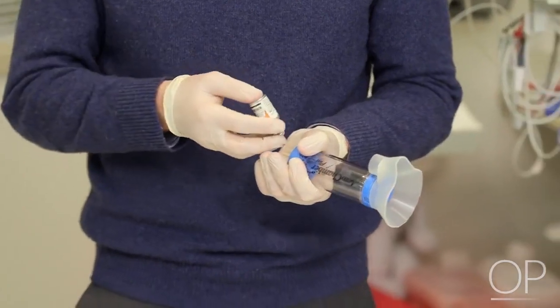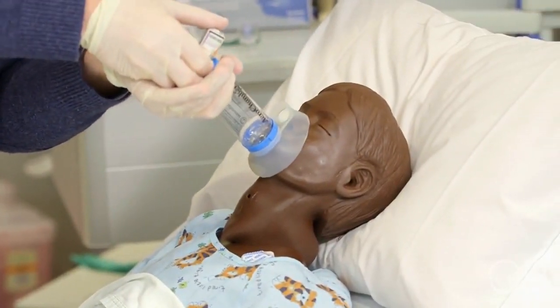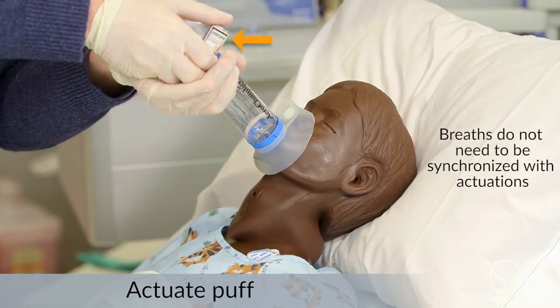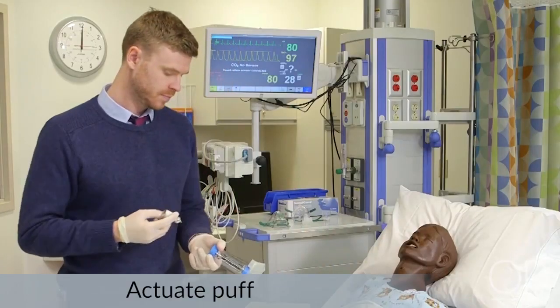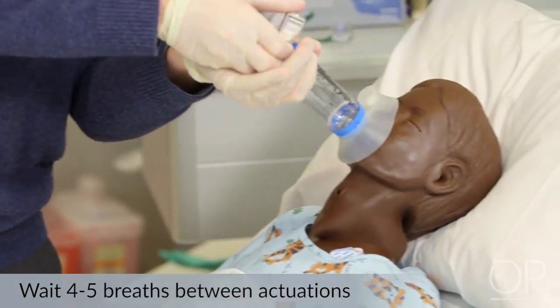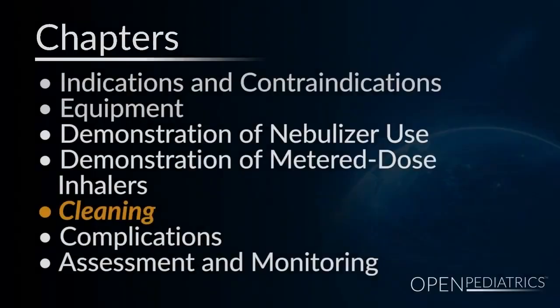Place it back into the plastic holder, place it into our chamber, and let's actuate a puff here and give it to our patient. Now, it's not essential for the patient to synchronize breathing with the canister actuation since we're using a chamber that helps to ensure the medication is delivered on demand. I'm going to shake for another 30 to 40 seconds after that actuation before we give our second dose. I wait 4 to 5 breaths between actuations to make sure that the patient inhales all the medication in the chamber possible.